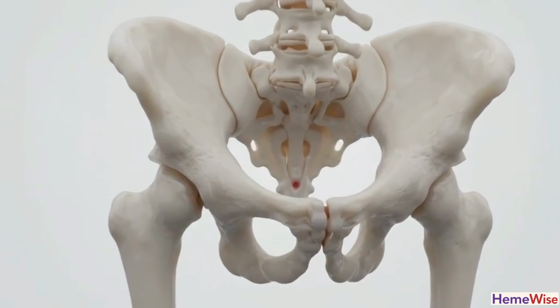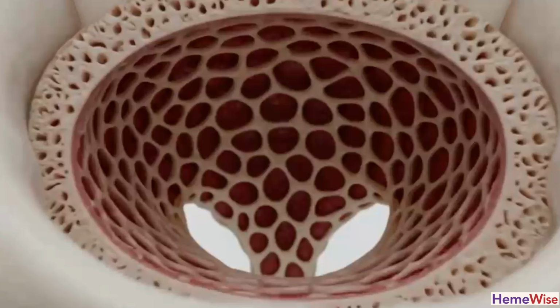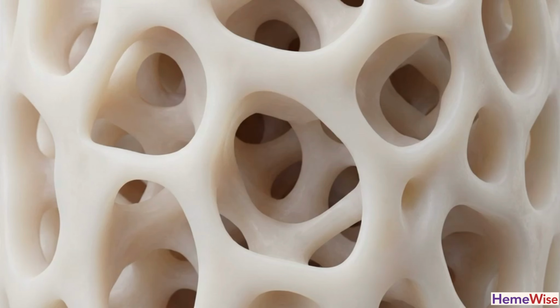Investigating a systemic hematologic disease at its source begins at the posterior superior iliac crest. This site provides a large marrow space accessible for sampling while remaining safely distanced from major internal organs. The internal marrow cavity is a highly organized microanatomy.